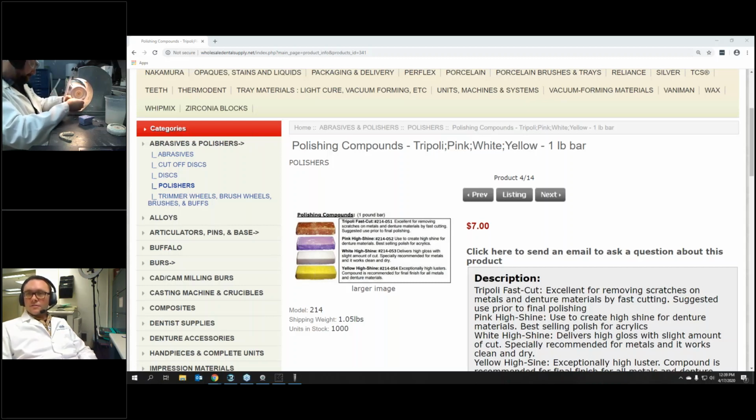We had another question from Kendrick. How do the layer lines in the resin affect the intaglio surface for patient cleaning? The outside's polished, but what about the inside? So yeah, it is a great question. We can't really polish the intaglio, the main reason being that all your fit goes out the window when you start doing that. So yes, potentially the layer lines, if you print in 100 micron layers, will make it harder to clean.